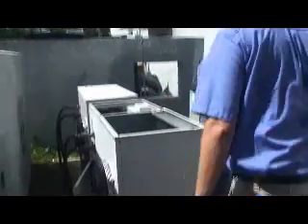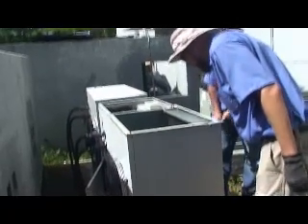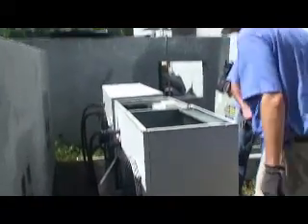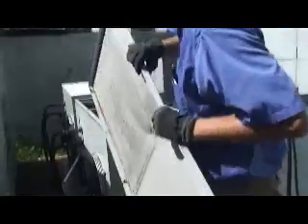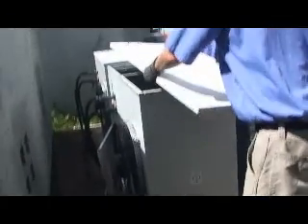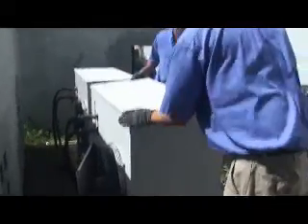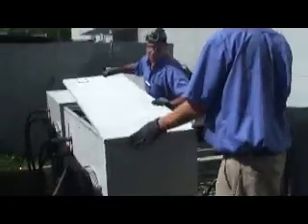Clean machine, and we can put the top back on the machine. Go ahead and grab the top, Chris, and we'll put the top back on it and get it back running again. If you have to use coil cleaner because they're that dirty, use a mixture of like 50-1 with a non-acidic solution. We're gonna have to get it around the edges first. That's good. Got the machine back on.